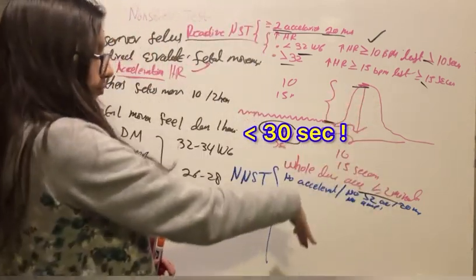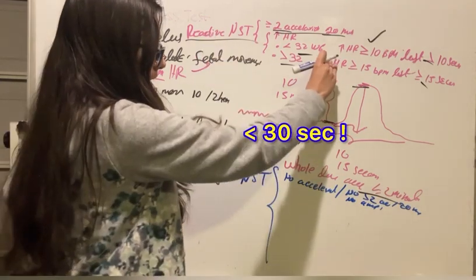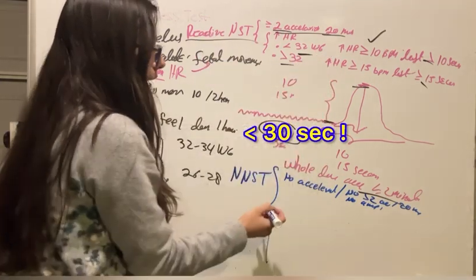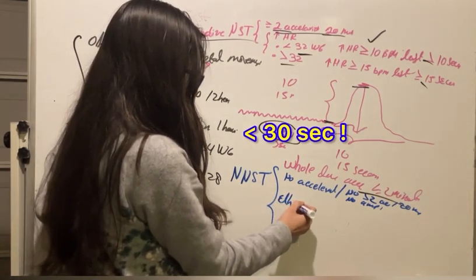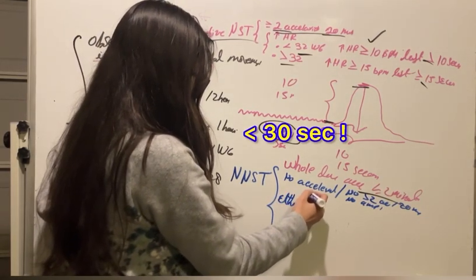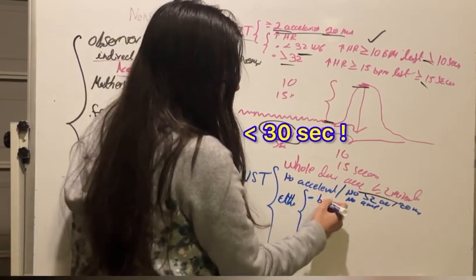So in summary, a non-reactive non-stress test is when this criteria is not met, and the most common etiology for that is that the baby is sleeping.